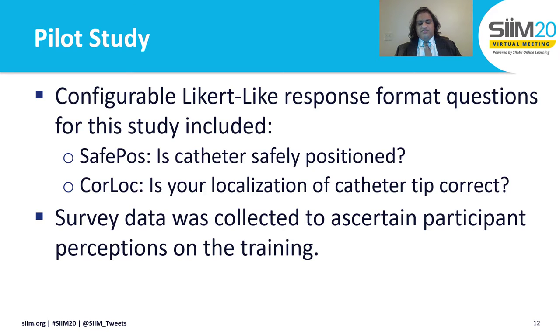For our pilot study, we used a configurable Likert-like response format, so trainees could assess, is the catheter in this chest x-ray safely positioned, and for the marking that they made for the tip, how confident are they that that's correct? The survey data was also collected to ascertain participant perceptions on the training and how their experience went.